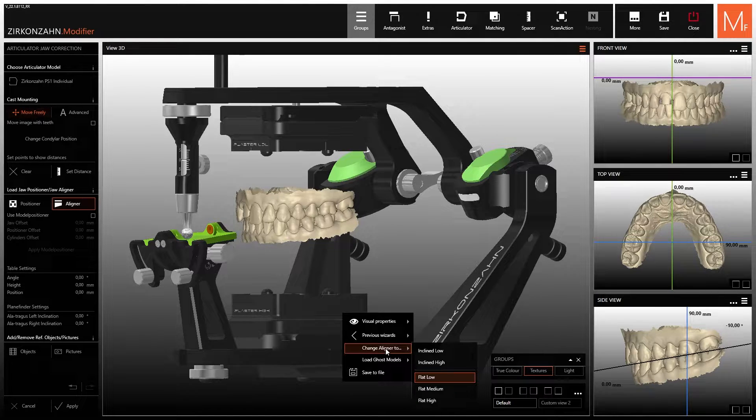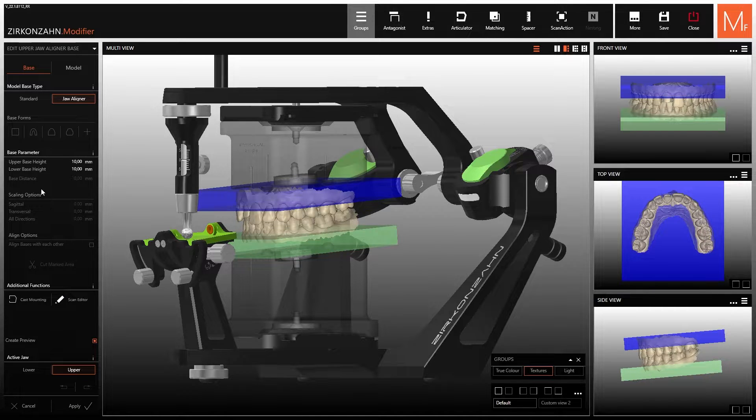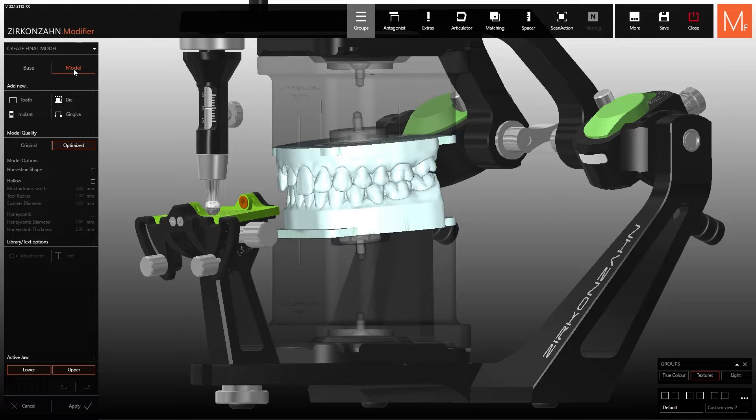At this point, select the third option to choose between the different heights of the inclined or straight kit. Once you have completed the base selection, click on apply to go on with the model design. Adjust the height of the model bases and select apply one last time. After that, you can proceed to select the function for creating models.